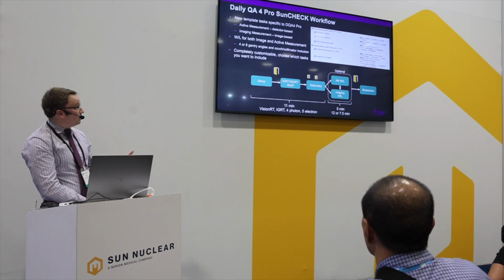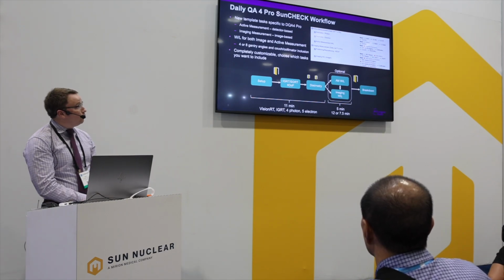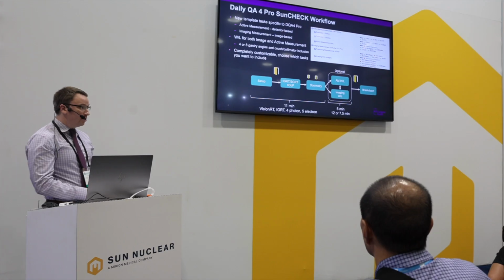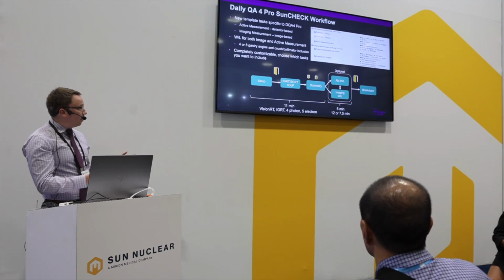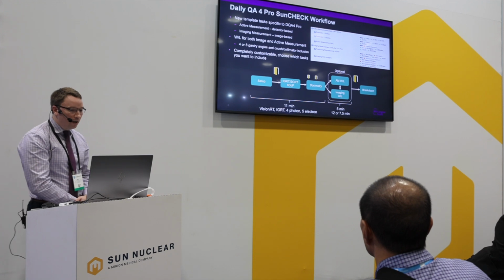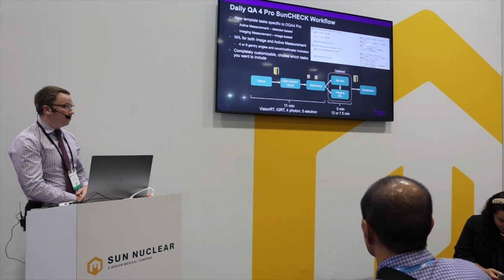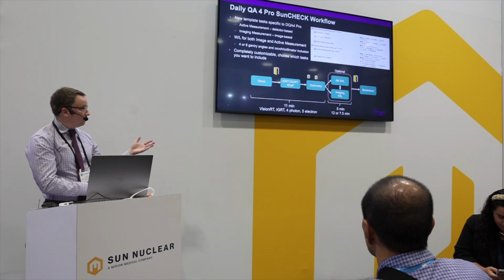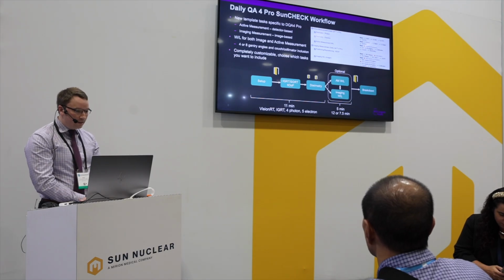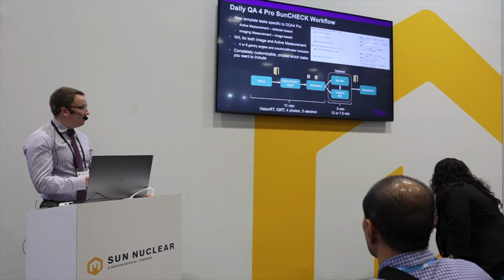So in the active measurement, you see we have the typical dosimetry for photons and electrons, and then that new active measurement Winston-Lutz, which is using the diodes placed around the device in order to calculate your isocenter. For the imaging measurements, we've got our typical positioning, repositioning, where you test your image guidance, now using the phantom for all of that, as well as the imaging Winston-Lutz, which is using those fiducials for the kV and MV panels.